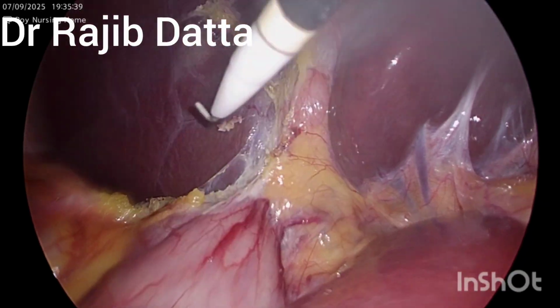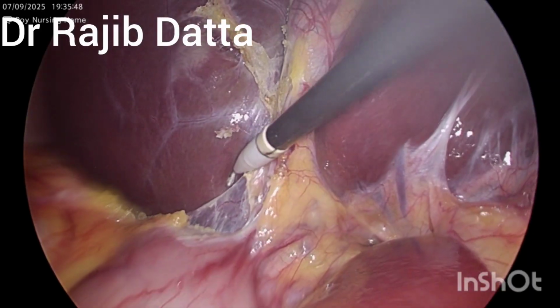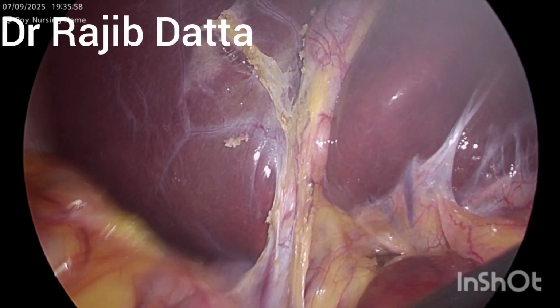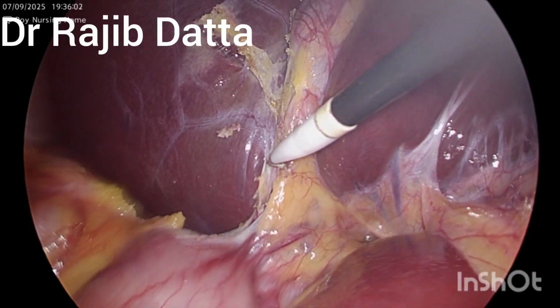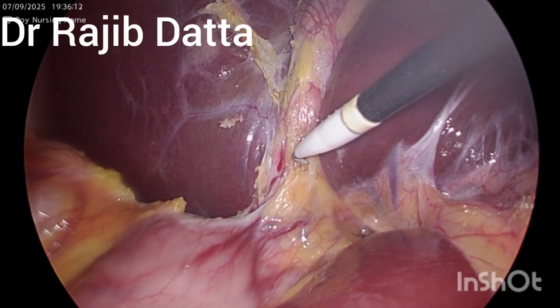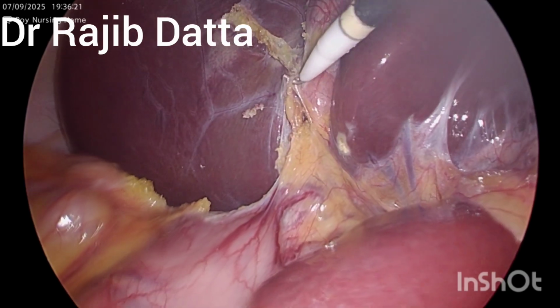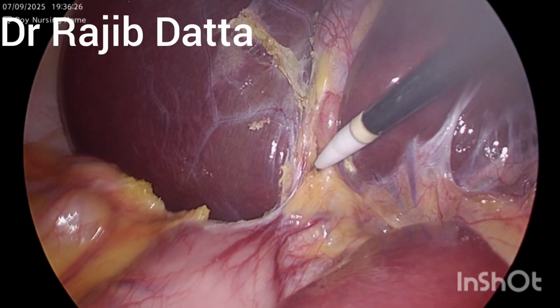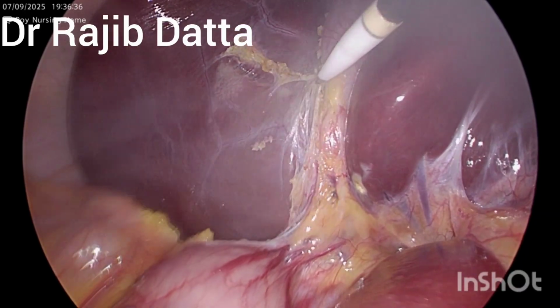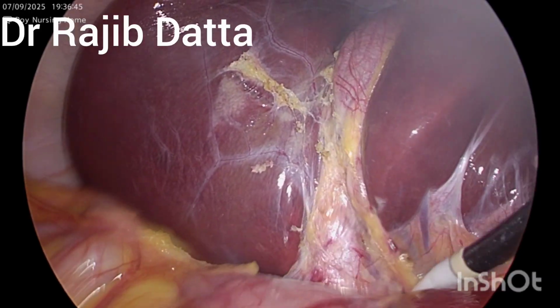Some fimbriae are there, and the cystic duct and the common bile duct can well be appreciated. Just behind this fibrofatty tissue is the common bile duct. So we are retracting the fibrofatty tissue away from our operative field, and you can see the lymph node of Lund or the cystic lymph node. So the cystic artery should remain to some extent near this lymph node of Lund.